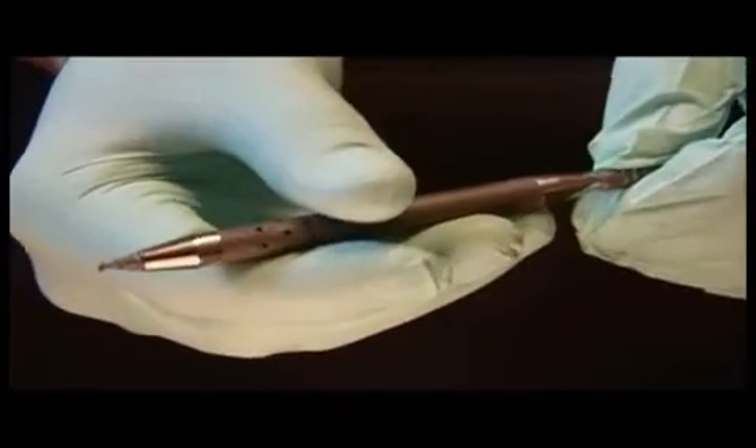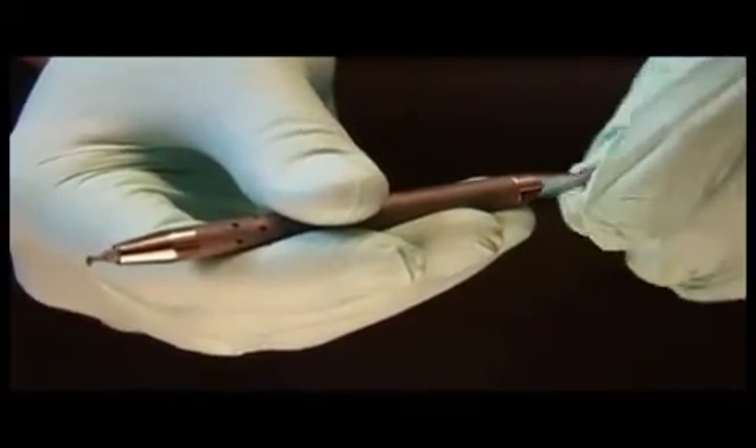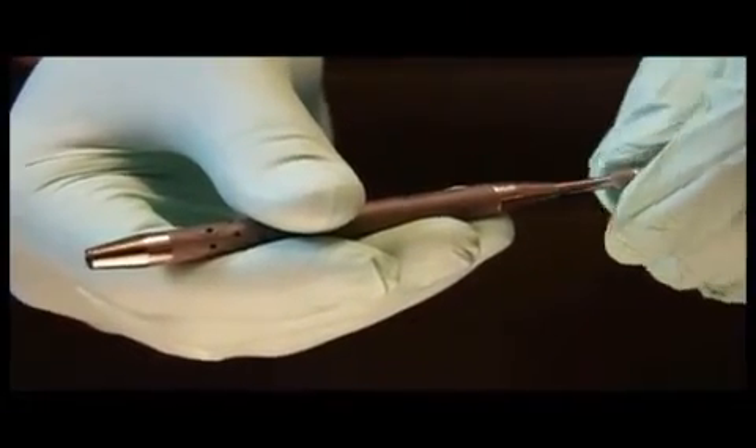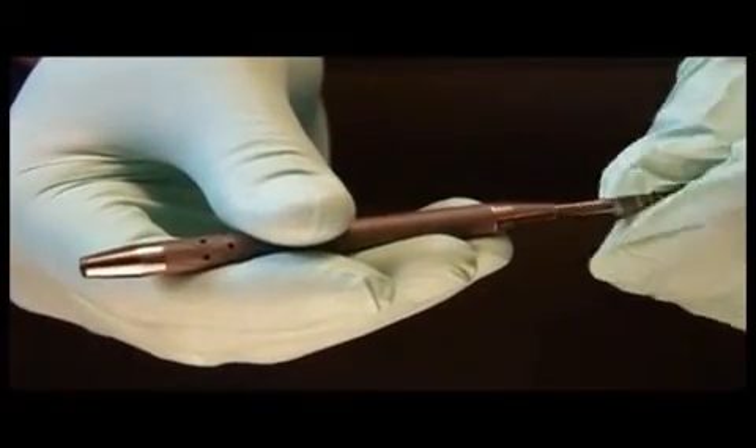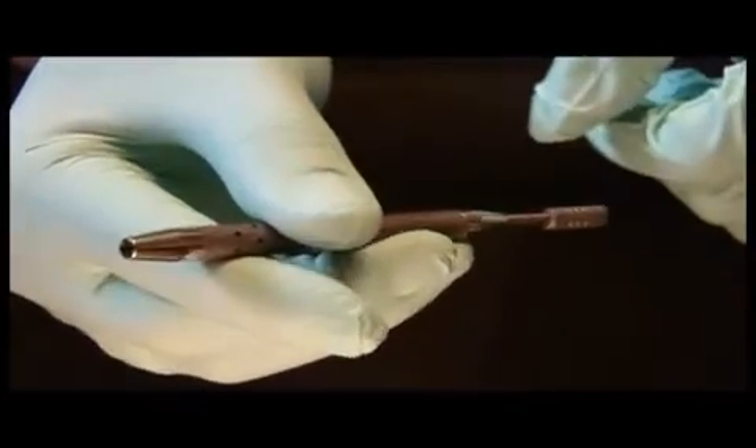When finished with use, retract the blade by twisting counterclockwise until free. Slide and continue to twist until locked in the retracted position. Always ensure that the blade is in the retracted and locked position for transportation and sterilization.